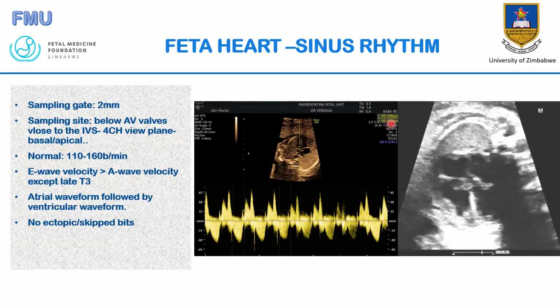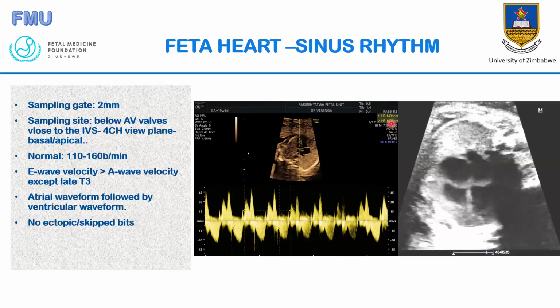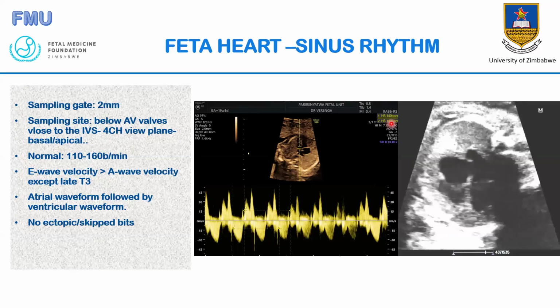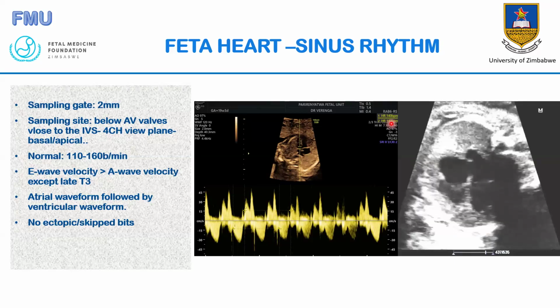Very important, because we're coming to abnormal arrhythmias, I think, in the next slide, so that you realize how important it is to do a fetal heart rate properly. So there is a lot of information we can obtain just from doing a fetal heart rate about the baby's heart.